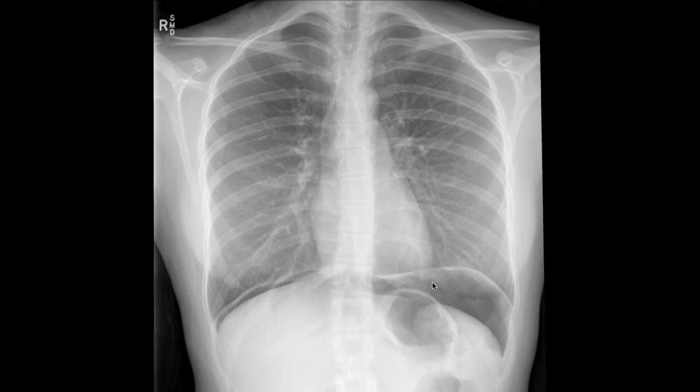And then we have the gas. See, the subdiaphragmatic gas has risen up against the gravitational force. That most likely indicates that the patient was in the erect or standing position. Look at the massive amount of gas under the diaphragm. Now, how do you diagnose subdiaphragmatic air? You look at the hyperdense line right here.